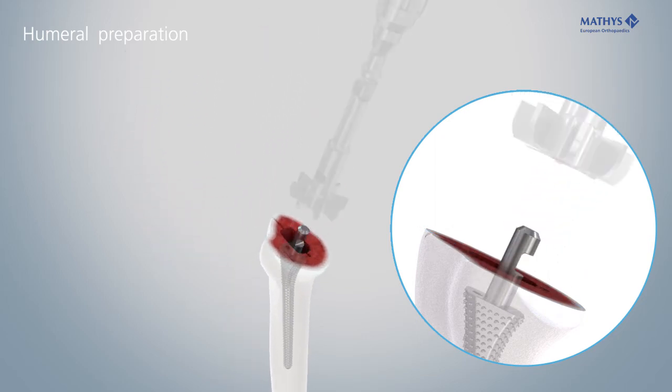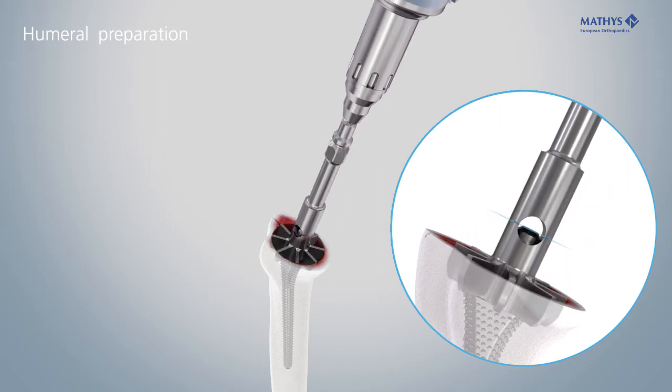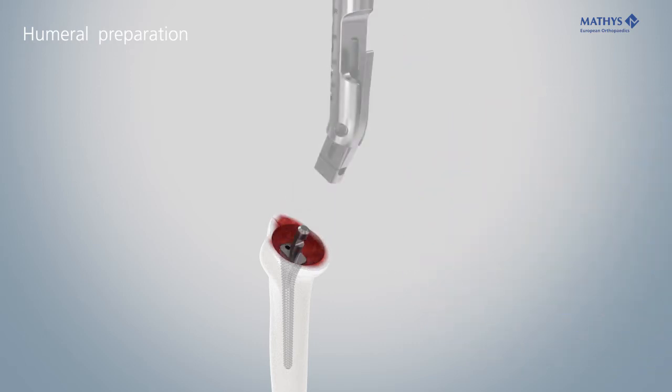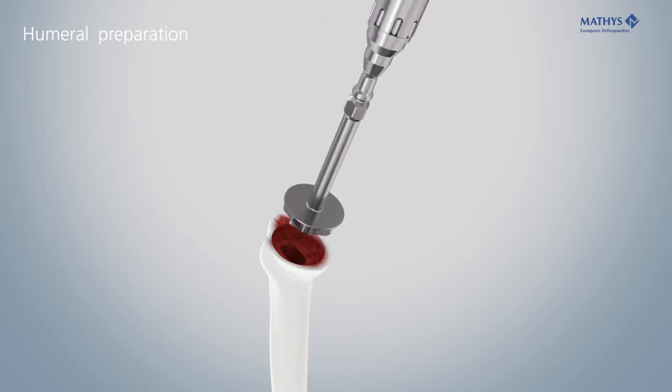With humeral reamer 1, the proximal part of the stem is reamed via the inserted rasp. To complete the humeral preparation, remove the rasp and finish the reaming of the metaphyseal cavity with humeral reamer 2.